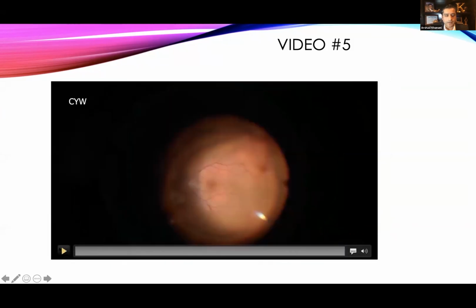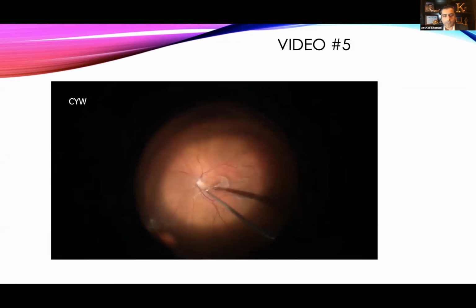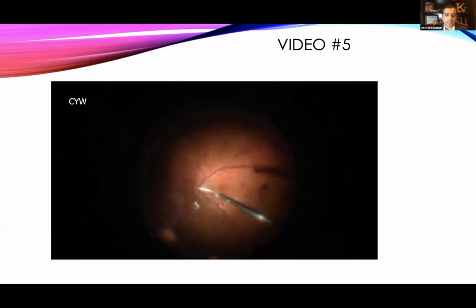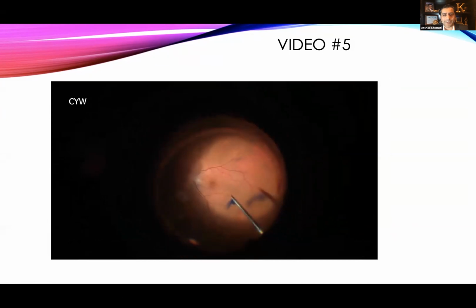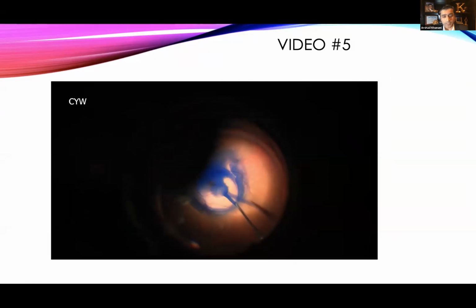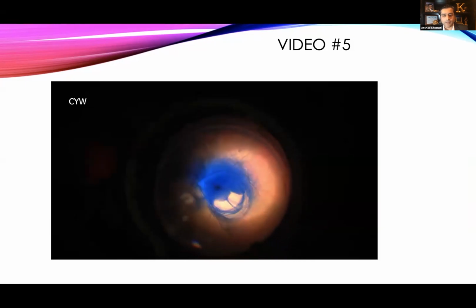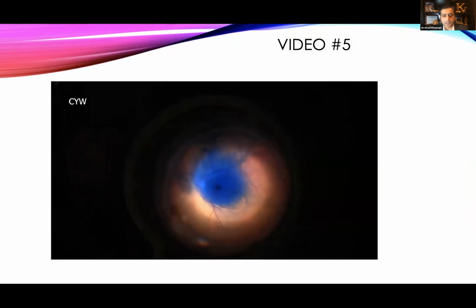So this is a video from Christina too. And you can see here, she's using triamcinolone and then inducing a PVD. And you can see the quality is much better in Baylor than it is in Reno. You can tell the beautiful video quality here. And in Houston, you can see that she's just like Carl. I mean, like your fellow, actually, Mitul, she's going pretty close. And like Carl, she's using a needle.